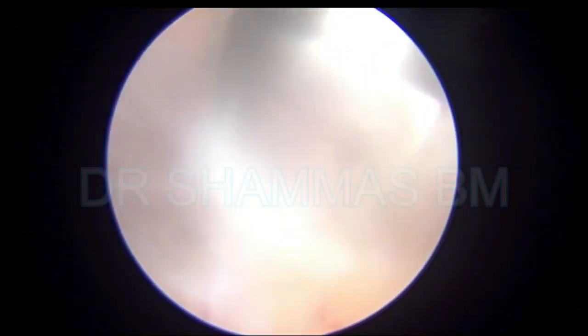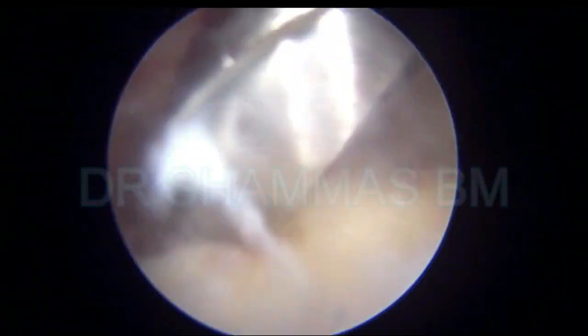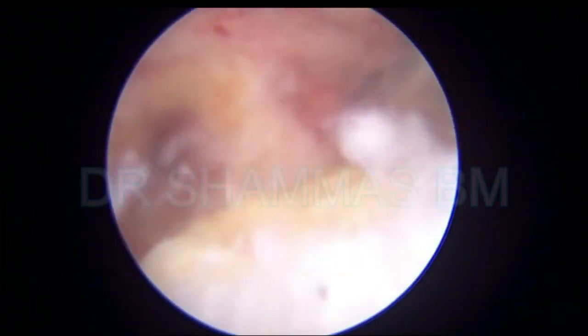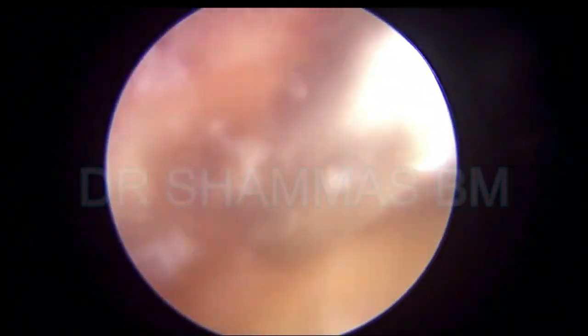This is on the medial side where the burr is working. The burr is a very handy instrument in this case — it will help you a lot in reducing the time of the surgery. We do not remove all the bumps; we want to retain some of them so that during fusion they will help engage into the opposite side and make fusion easier. But we do not want any soft tissues left inside — all the fluffy white soft tissues inside the joint must be removed.